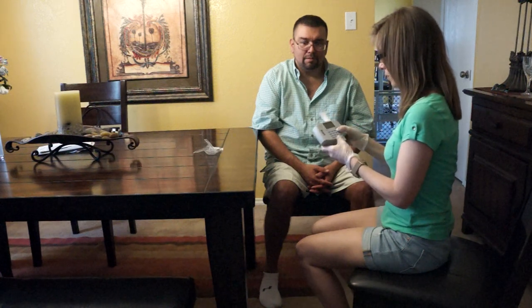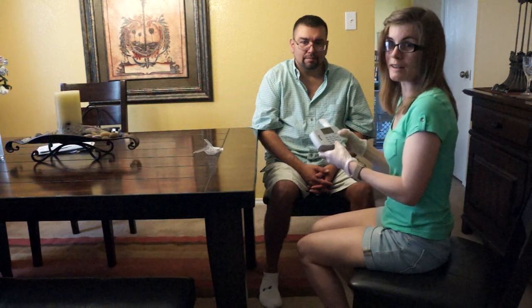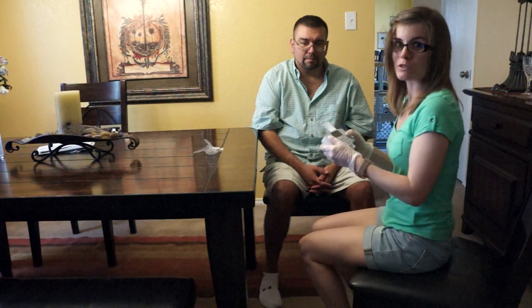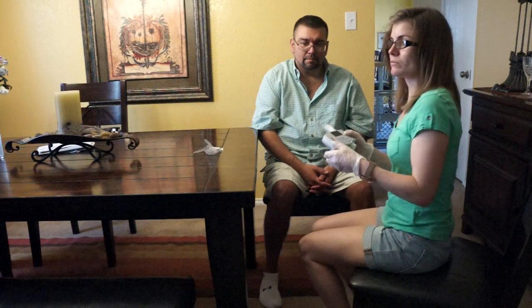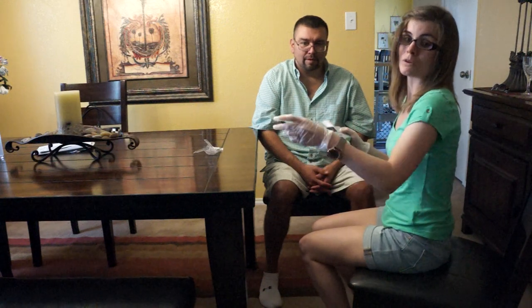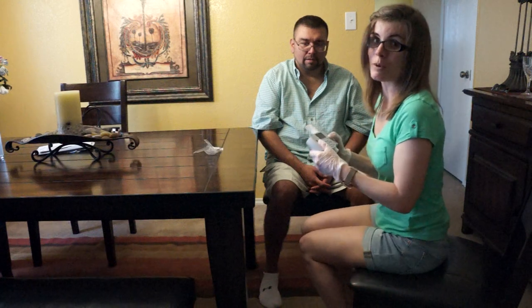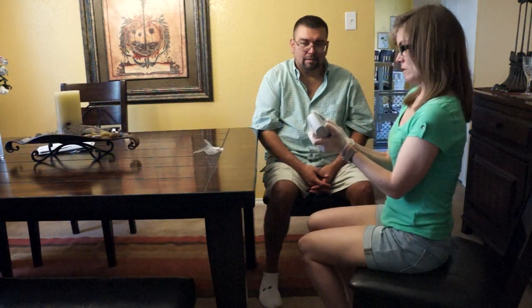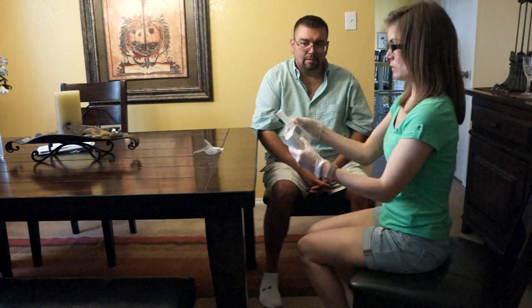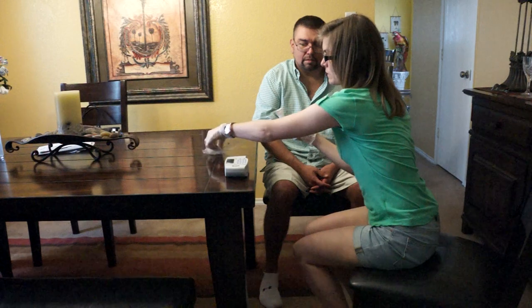Okay, so after that, you just turn it off. And of course, you can print your data, look at the data, and everything like that. Whatever you need to do next, whether you need to download it and upload it to computer software, you can also do that from this EasyOne spirometer. Then you just push the bottom of this out, and make sure that you dispose of it, along with the nose clips and the gloves.